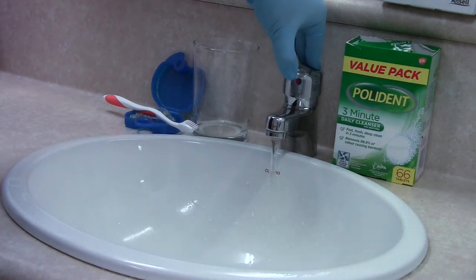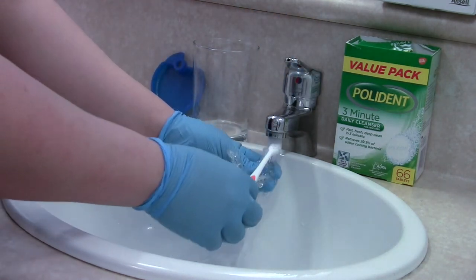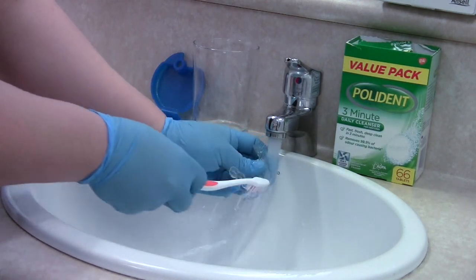After each meal, rinse your aligners under cold water and use a soft toothbrush to give it a little scrub before you put it back in your mouth.